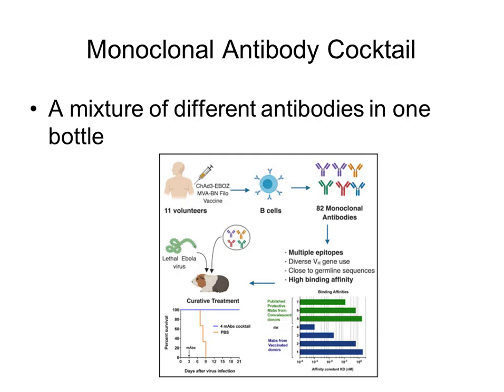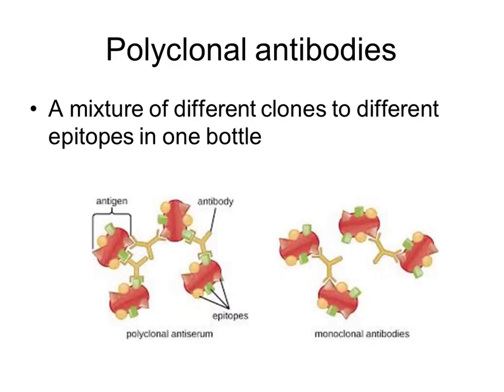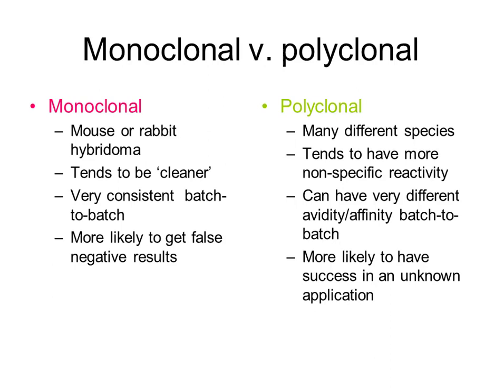Antibody cocktails can also be present. It's a mixture of different antibodies in one bottle. And the last is polyclonal antibodies. It's a mixture of different clones to different epitopes in one bottle.